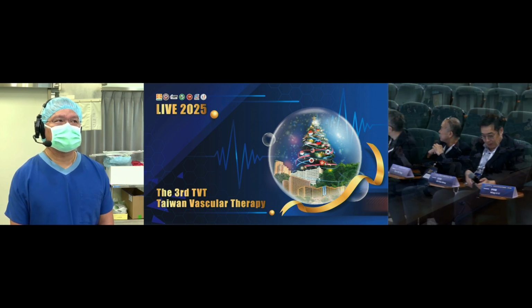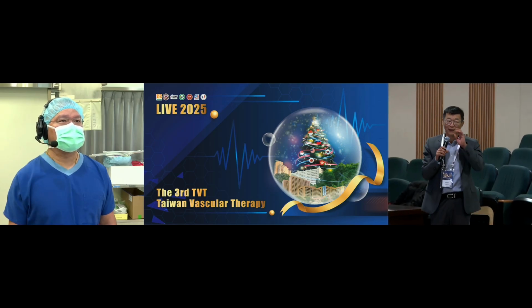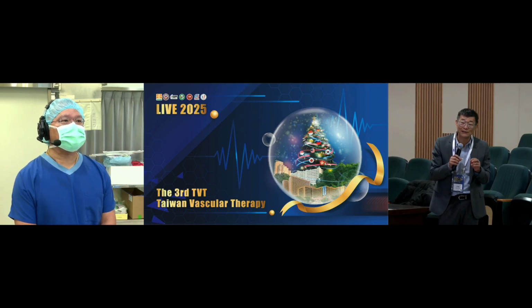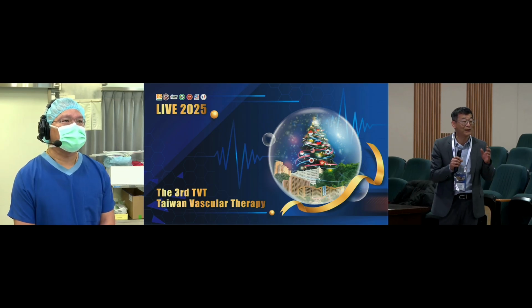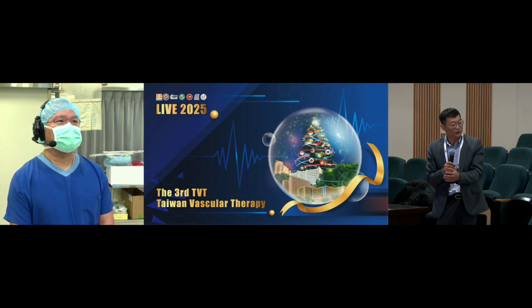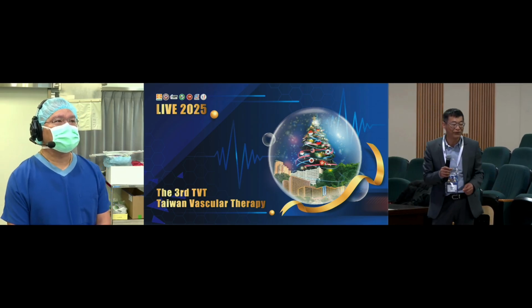Dr. Lee. I'm Dr. Lee Mini. Dr. Zhang, I have one recommendation. First of all, I believe more than 3 centimeters will be the more suitable indication for high-risk patients. In such an 80-year-old patient, we should extend to a larger size, more symptomatic, for the true indication to do something.